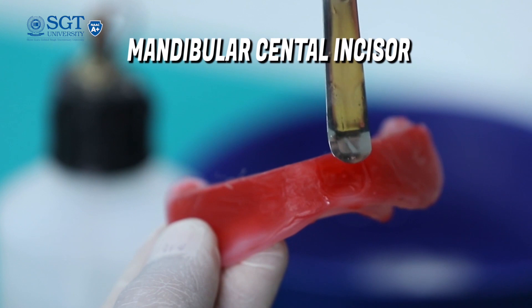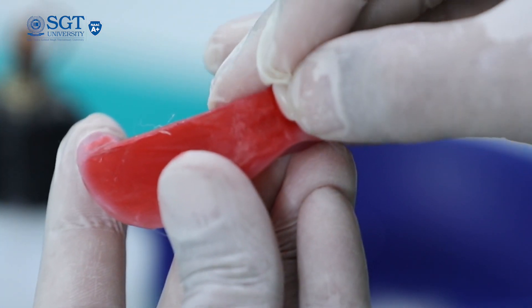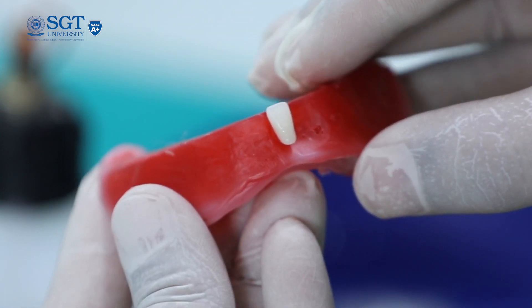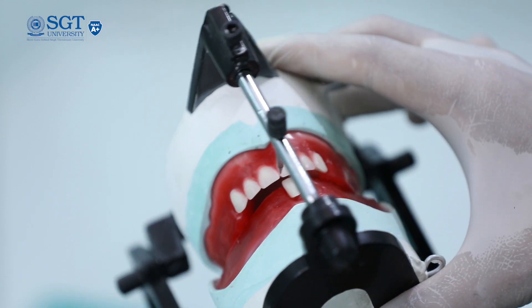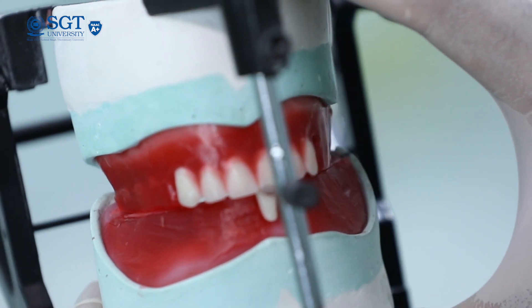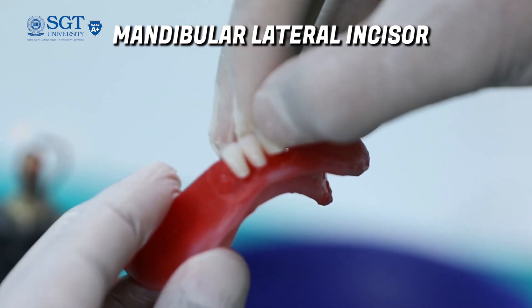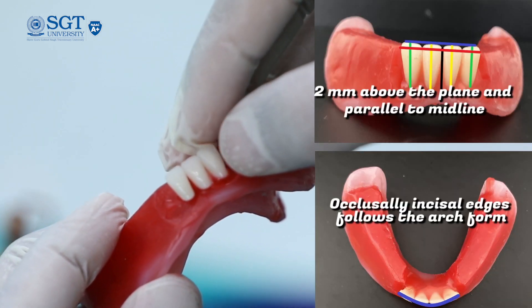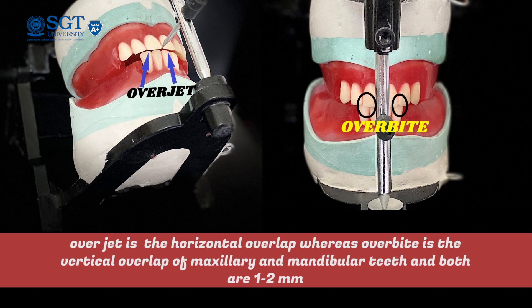After completing maxillary anterior teeth, we start with the mandibular anterior teeth. First, we arrange the mandibular central incisor. In the frontal plane, the midline of the lower central incisor should coincide with the midline of the upper central incisor. The incisor must be above the level of the occlusal plane by 1-2 mm, and proximally it should slope labially. The mandibular lateral incisor, when viewed from the frontal plane, is parallel to the long axis and is 2 mm above the occlusal plane; proximally it slopes labially and follows the arch form. After arranging mandibular incisors, when we close the articulator, we should have proper overjet and overbite.